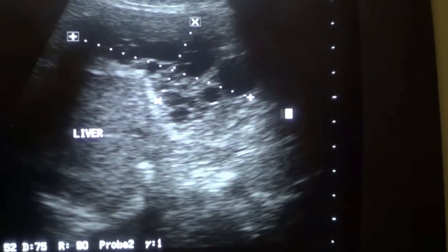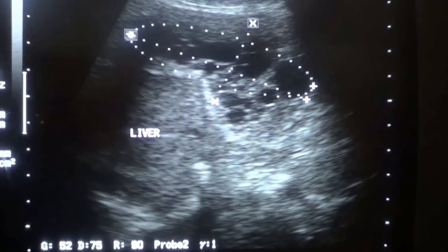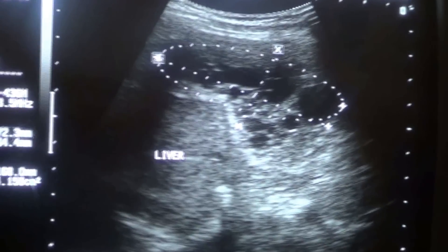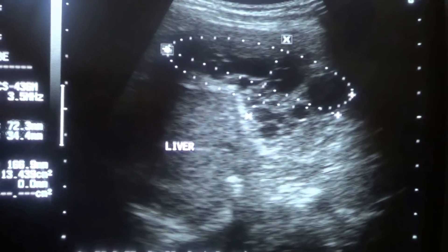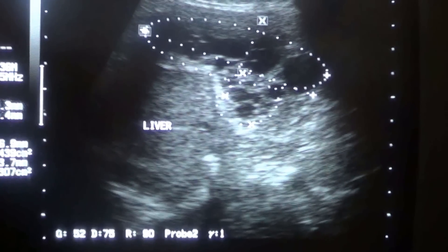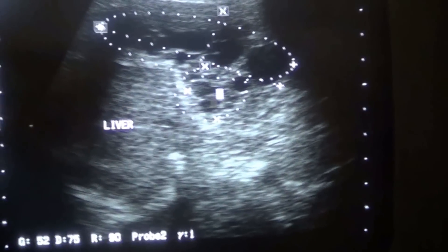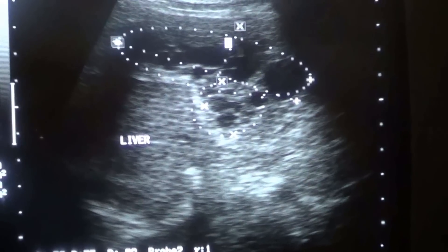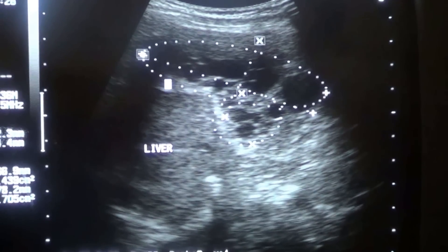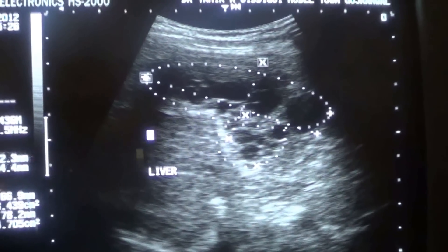This is the main cyst, which measures approximately 7.2 by 3.4 centimeters — this is the main bulk of the cyst — with a small part here. If you see, there are multiple cysts: this one, this one, this one, this one — small, medium size, and large types of cysts are all present within this main cystic area.